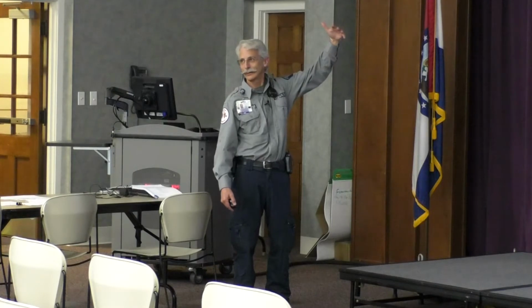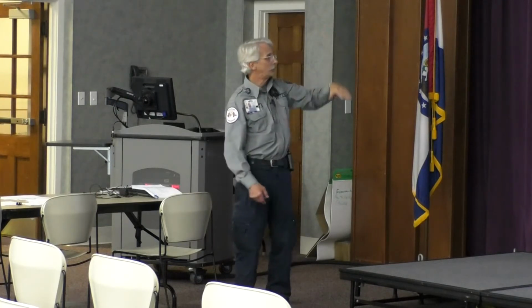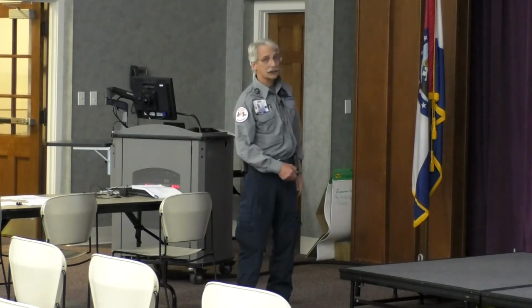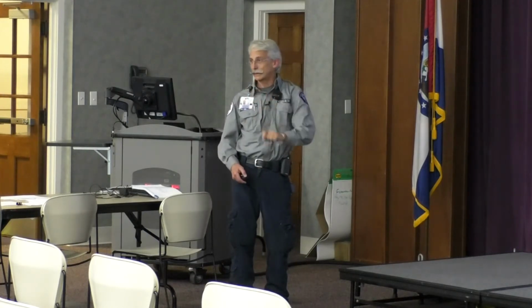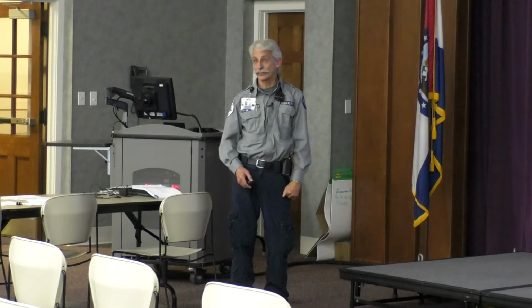That's kind of cool, right? I could, because the machine will do it. We just don't have paper. That's just silly to make paper like that, okay? But we could do that, because it only needs to look at 1 beat in each lead. That's really what it's doing. It's going to pick a beat in each lead, and that's what your monitor is running off of.